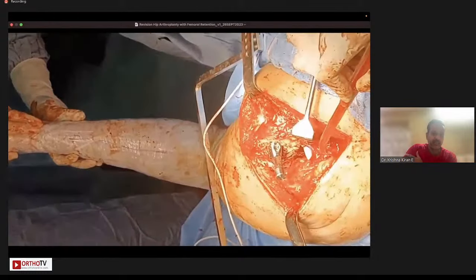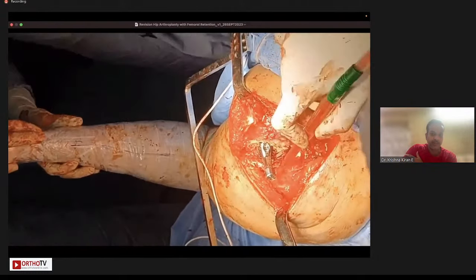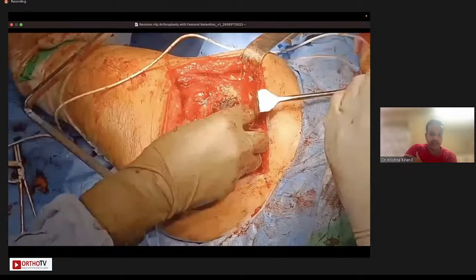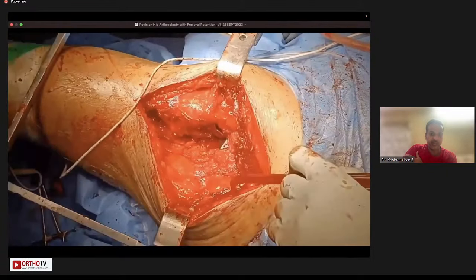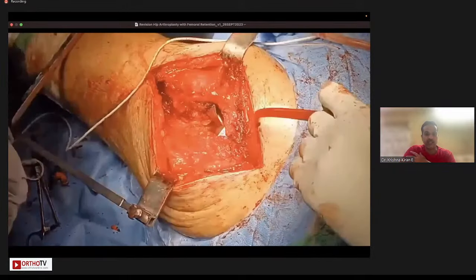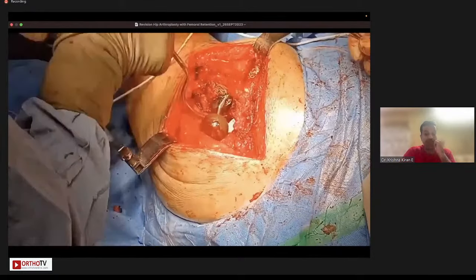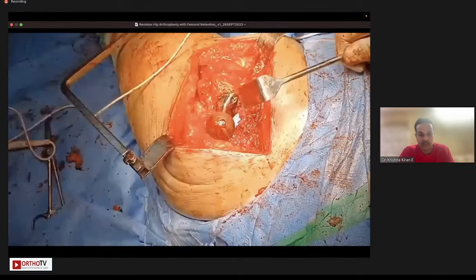And you can see here that I'm checking for the version of the femoral component and it looks good. And then we do subsequent trial reductions with 0, plus 5 and so on and so forth to check which is the best possible stable situation for this particular patient. Take the patient through range of motion.